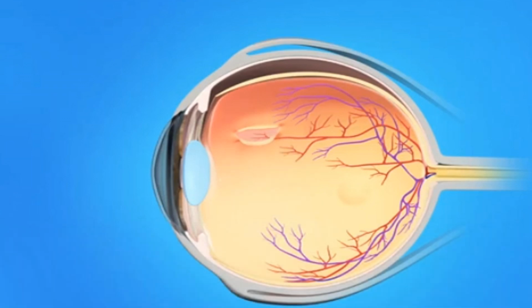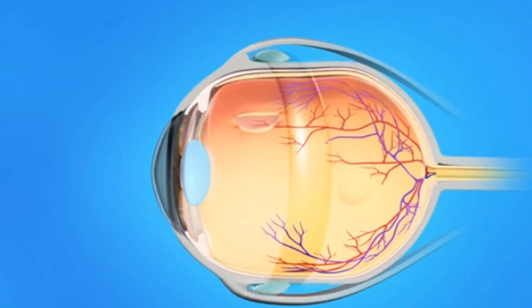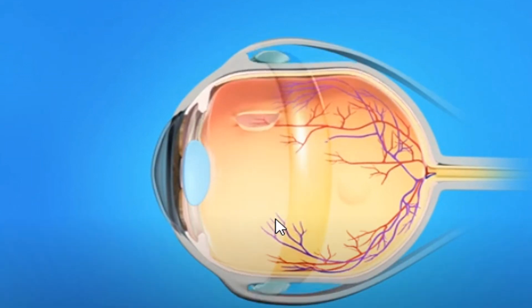He used the scleral buckle. What does it mean, scleral buckle? Like this. It's like a belt, like a tight belt. We are bringing here this normal area to this detached retina. Actually, we are pushing from the choroidal side and from the scleral side to inside.